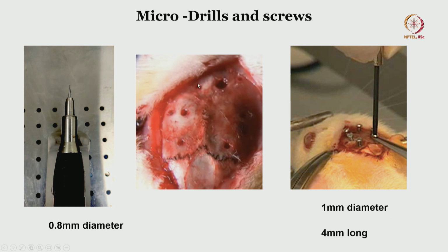So that will go through this bigger burr hole. Even if it's a depth electrode that you're trying to pass into the brain substance, once it goes in, you want it to stay within that area. And it's not enough to just put dental cement around it, because the rat is going to pluck it out.